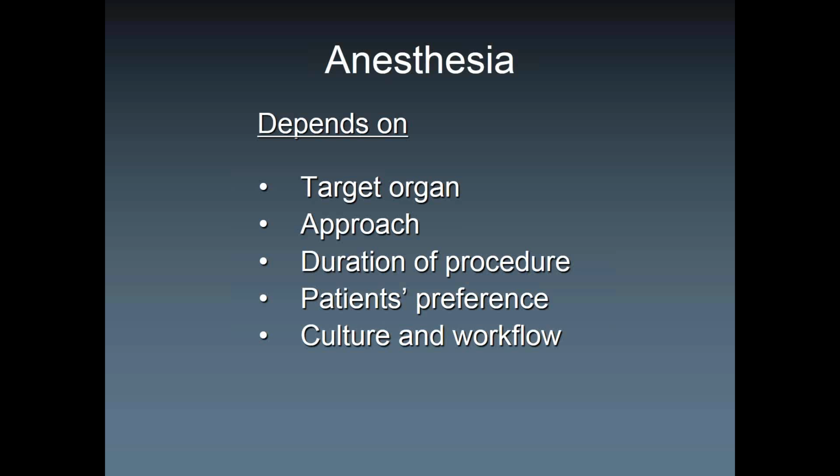And you have to decide on what approach you're going to do, without going through bowel if you don't need to. You can, but not with all gauge size needles, obviously. You have to keep in mind how long the procedure is going to take and also what the patient would like. That's a more and more important factor nowadays, where patients have more and more to say about what they want, which is totally okay, but we have to be considerate of that.